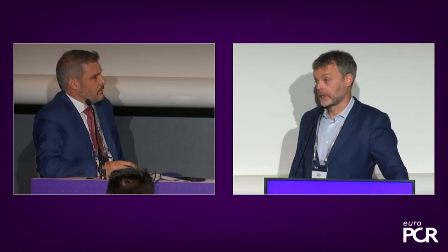Yeah, it's a great question, actually. I think we did the first report on reverse CART with lithotripsy. So the answer, as it currently stands, is that the lithotripsy needs to be intraplaque to modify it. If you're trying to understand reverse CART, what you're trying to do is create intimal tears between the intima and the media for that to work, and it's only going to work intraplaque at the moment. We've tried it extraplaque in the subintimal space, and I think it's just too far; the energy dissipates before it makes proper modification. And I don't think anyone's tried it retrogradely because the devices are a bit bulky for that. But it's an idea.